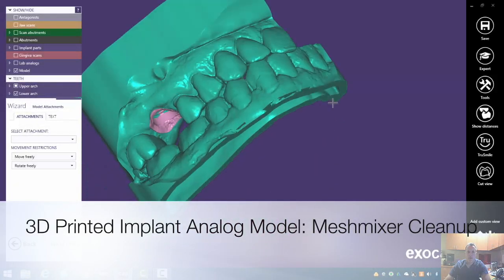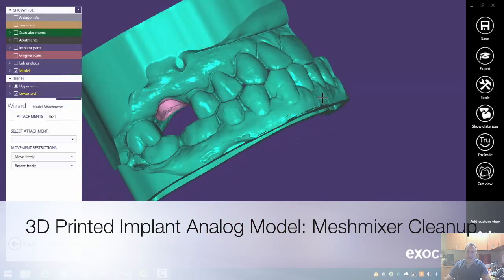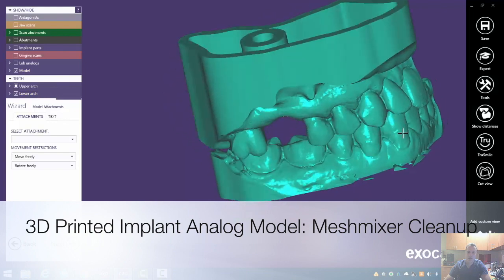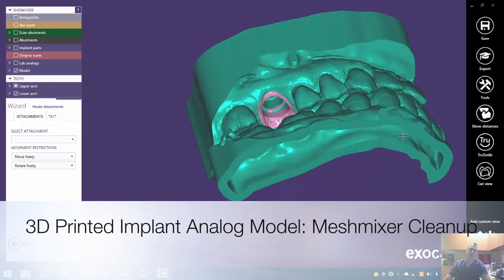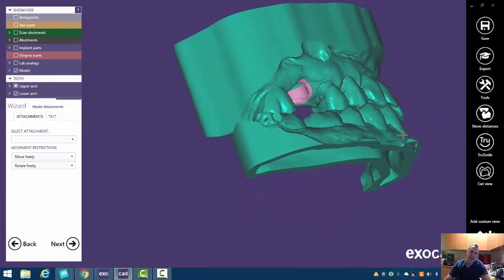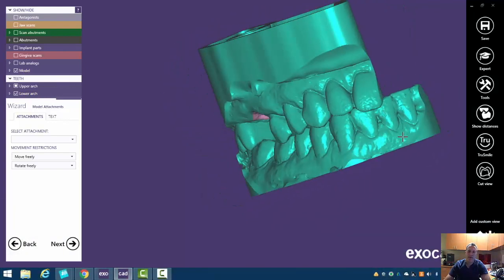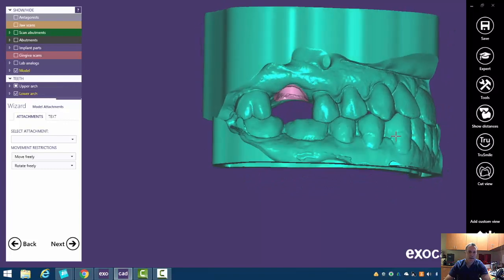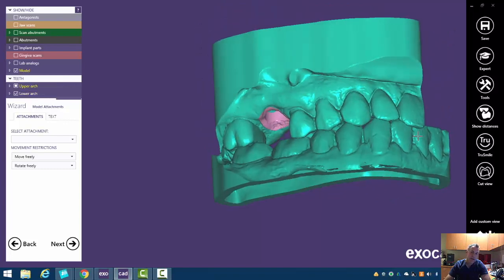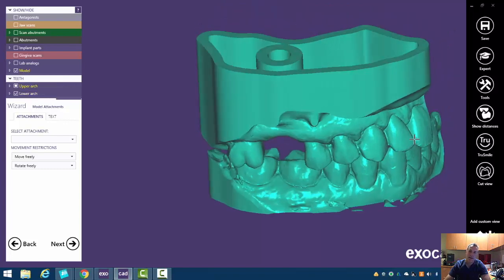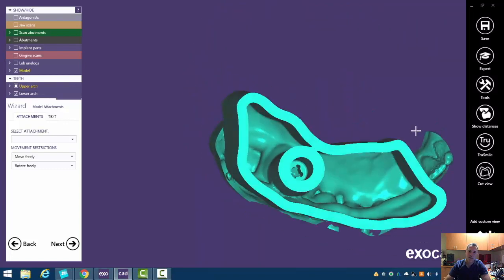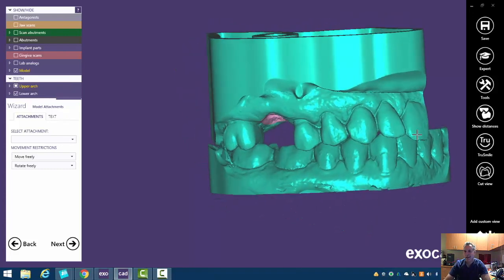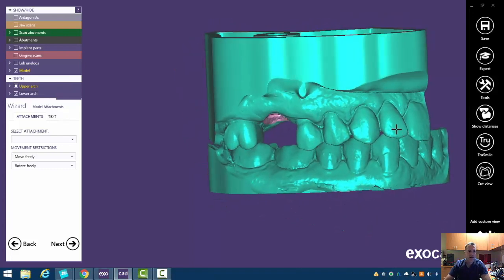In this last video we're going to go over model attachments. One thing that's cool about 3D printed models is we can articulate them, and there are lots of different disposable articulators or fully adjustable articulators you can use if you want to. In this case we're going to use just a little quadrant one.